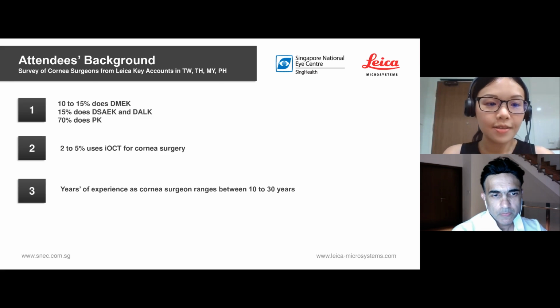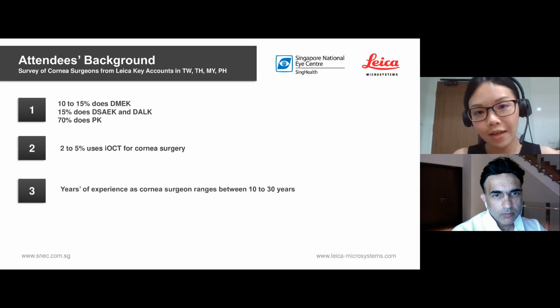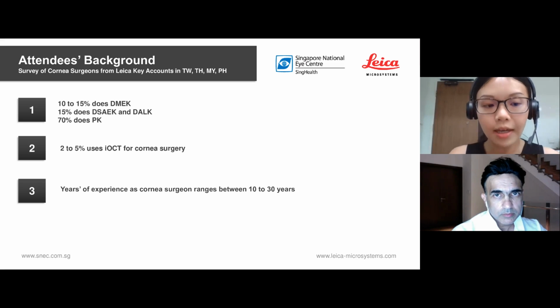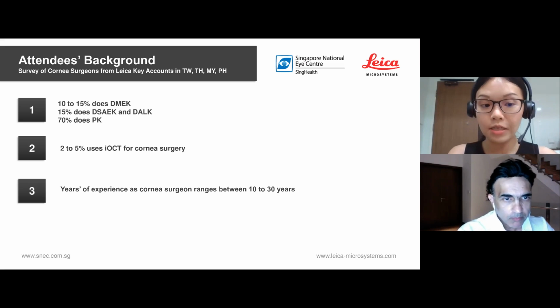Just a background on why we are doing this talk. When we did a very quick survey of the Southeast Asia region, we realized that a lot of cornea surgeons in the region are still doing the PK procedure, and not a lot of cornea surgeons are using intraoperative OCT for cornea surgery.